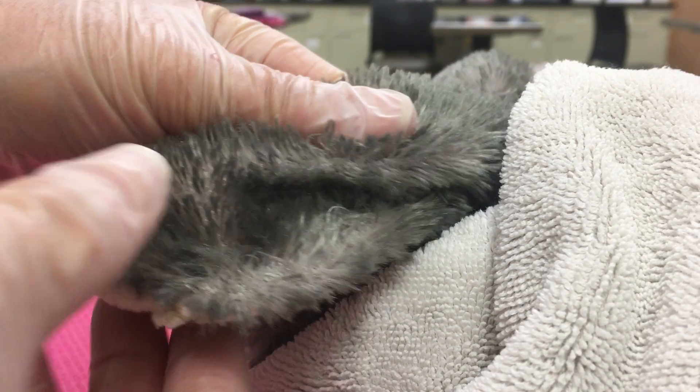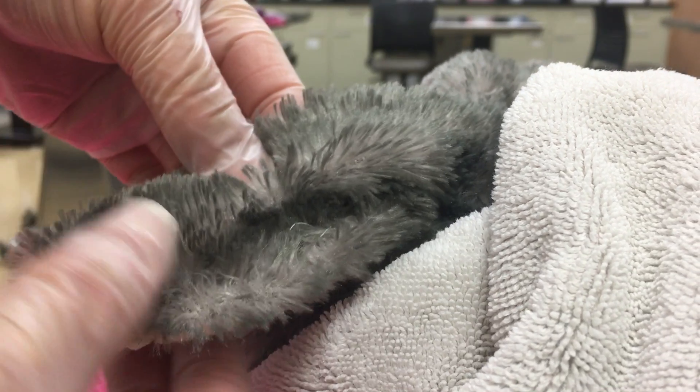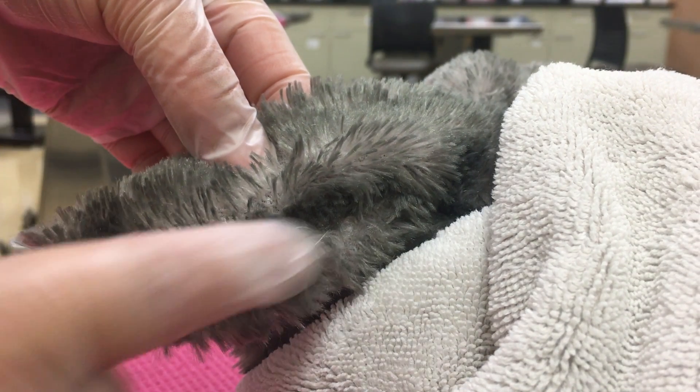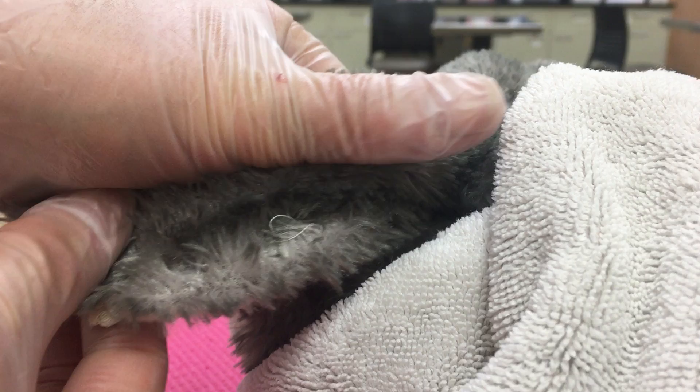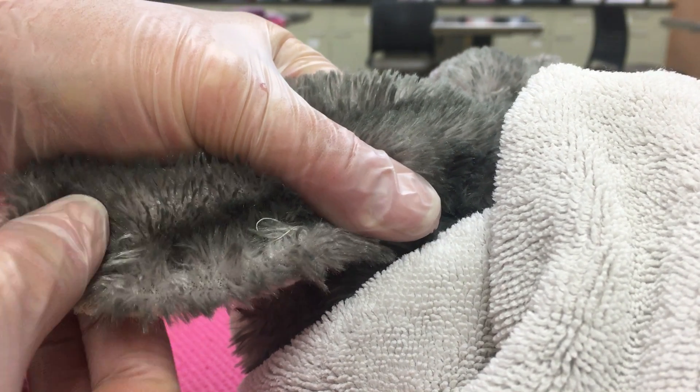I'm going to show you a little closer how this would work if this was a rabbit. So this is the rabbit's ear. We're doing the caudal vessel. So I would either hold this ear and put pressure on the proximal part of that vessel.